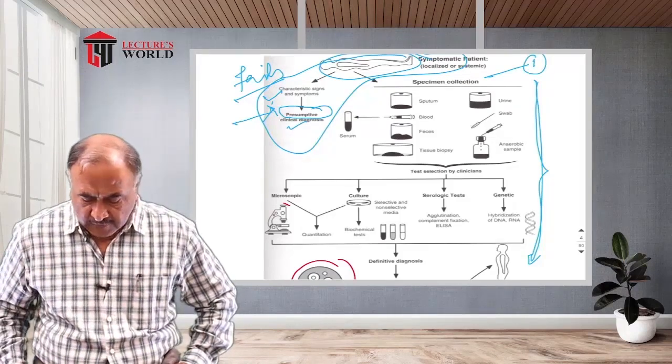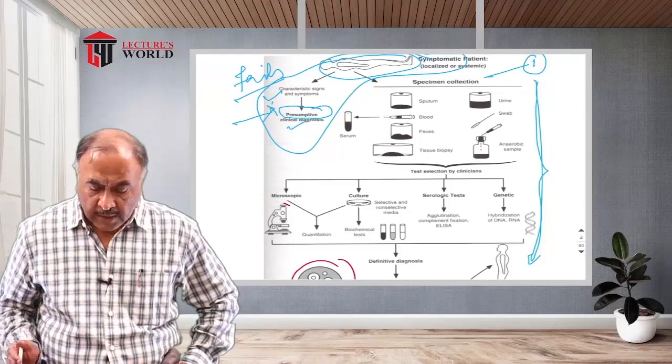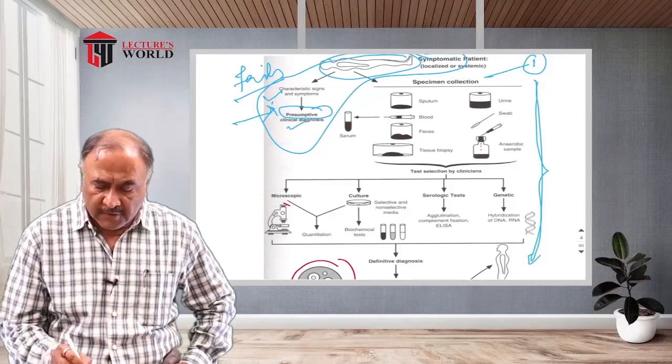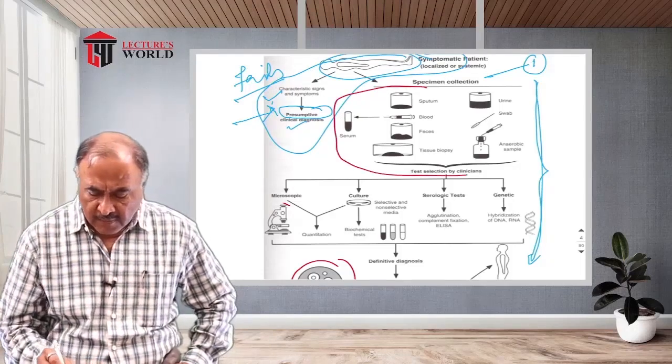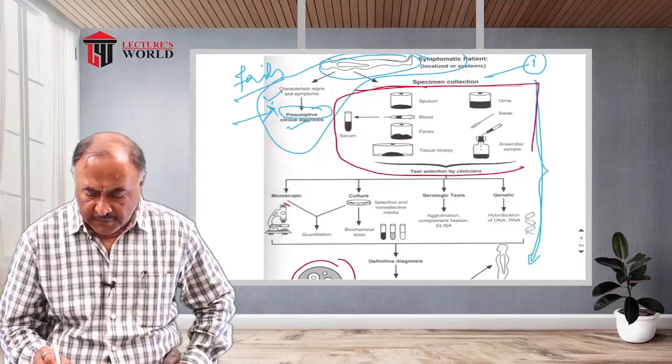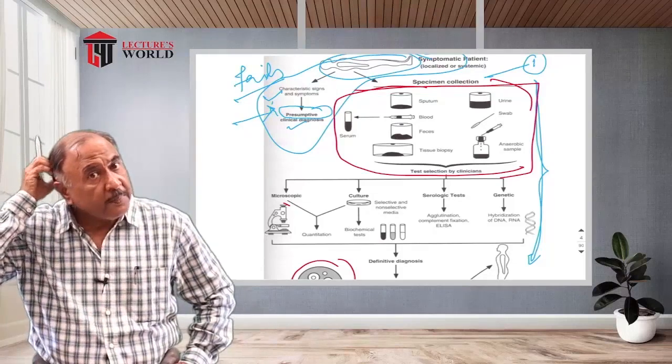So the first step is specimen collection. The collection can be done by using many different specimens. It is the choice of the clinical person.